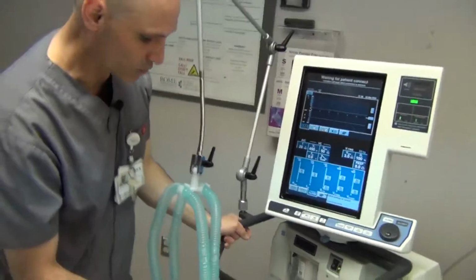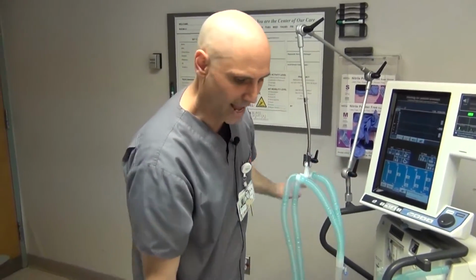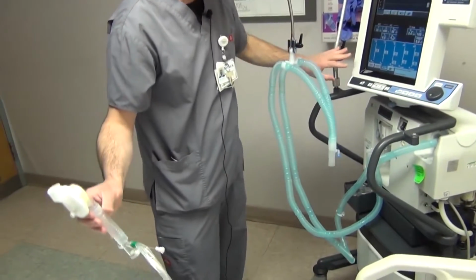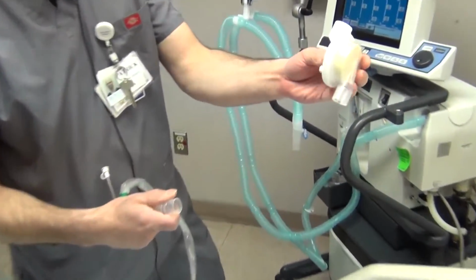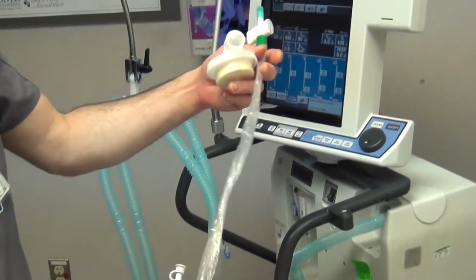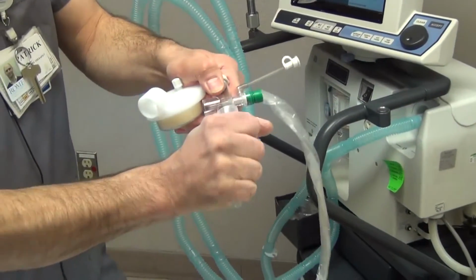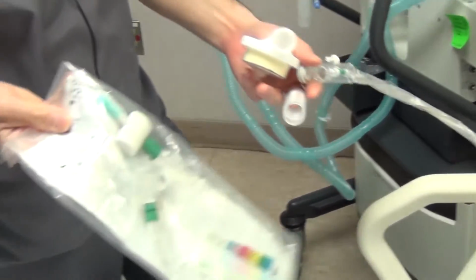Now that we're ready, we're going to be connecting to the patient. We usually have a little white bag hanging right here, and we're going to have these parts right here: an HME and a Ballard suction. And this also comes apart when it's in a container. Let me show you what that container looks like right here.